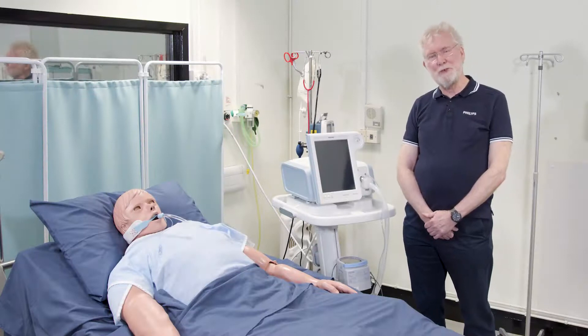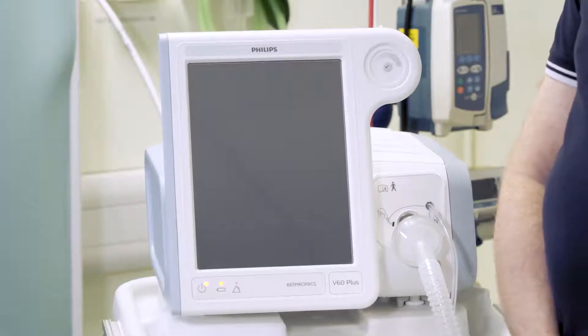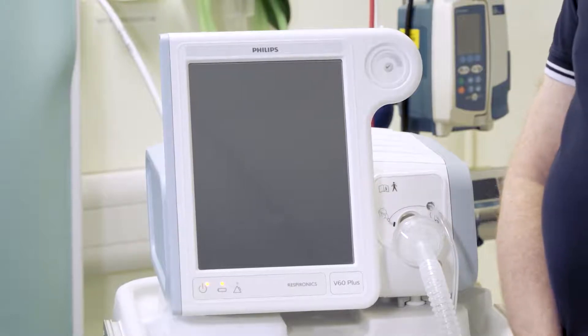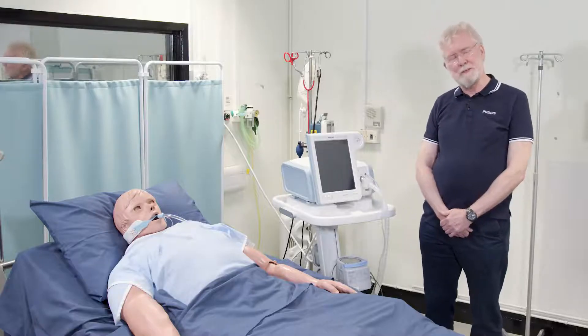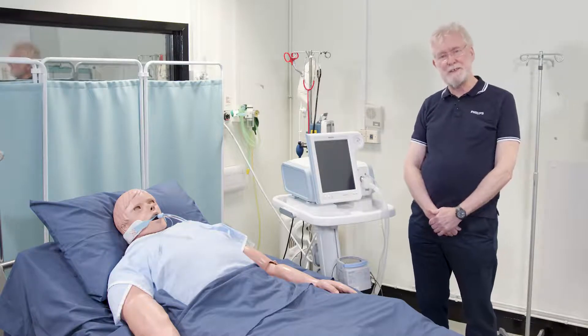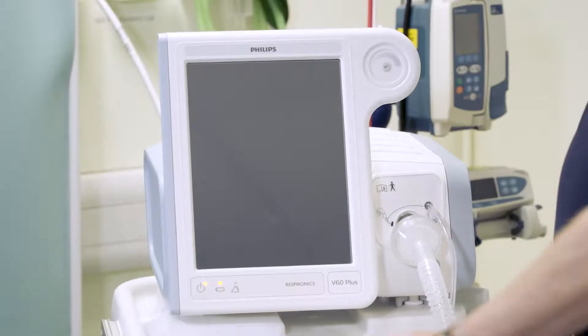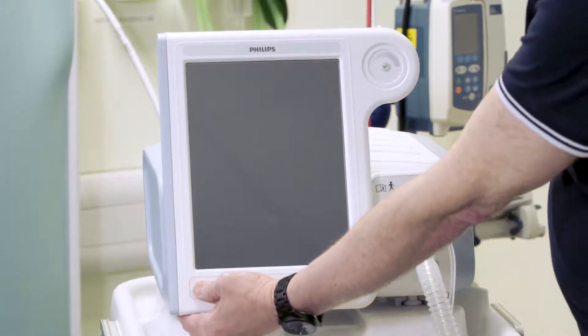The key purpose of this short video is the use of the V60 and V60 Plus in invasive ventilation. It's important to mention that the actual device is not licensed for life support, but it is licensed for invasive use and can be used in invasive modes.